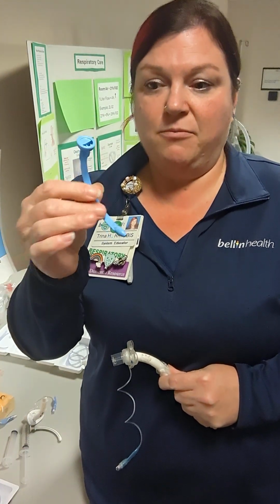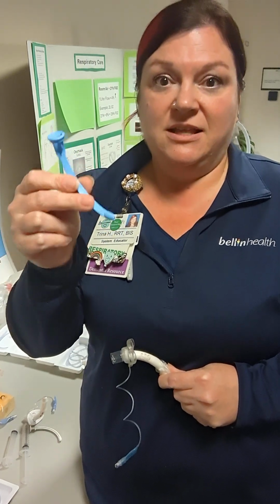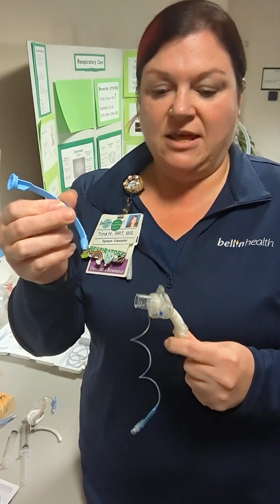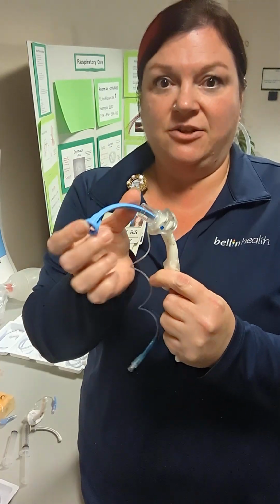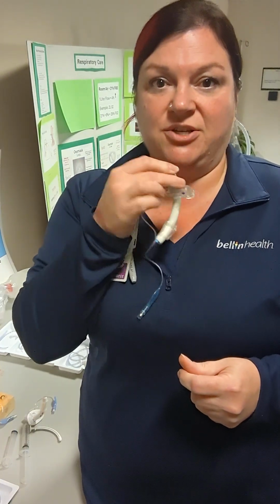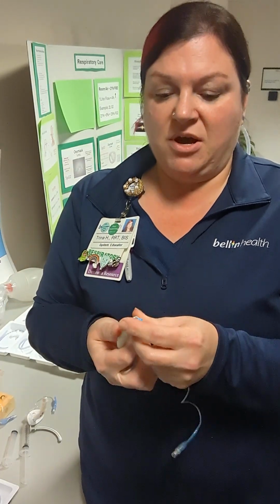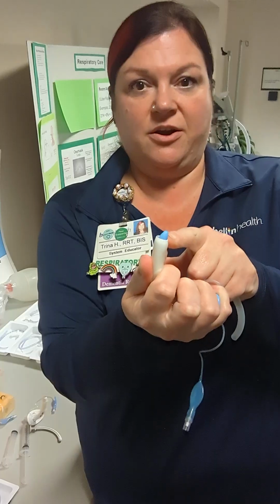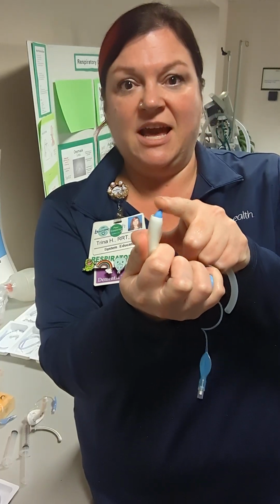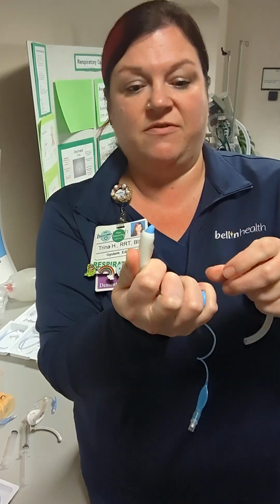You're going to have a hard, pretty rigid, what I like to think of as a guide wire. This is called an obturator, and the obturator needs to be inside the trach when we're going to insert it into the patient's airway. The reason is because the bottom of the obturator is domed like that, so it's not going to cause damage to the tissue of the airway.